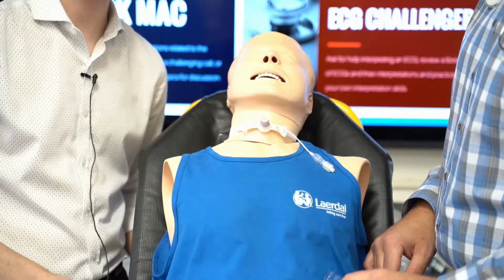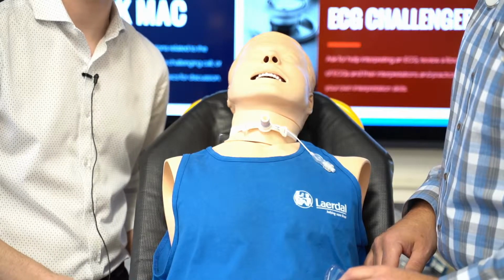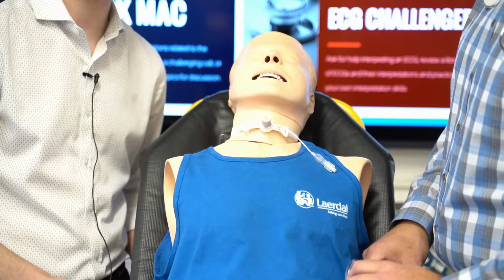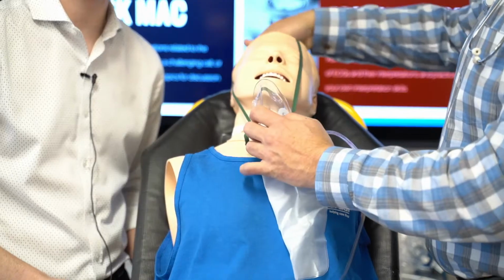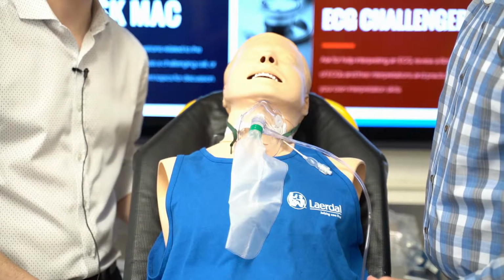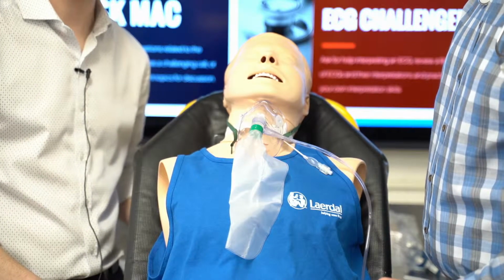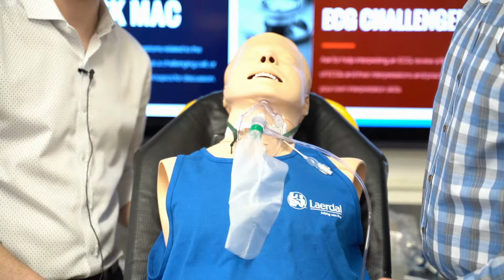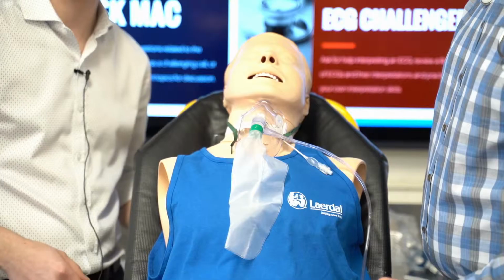With this tracheostomy patient, we've noted that there are increased secretions requiring some deep suctioning. This patient meets all the indications to apply this. First, we're going to pre-oxygenate our patient. And if we haven't already done so, we're going to prepare our equipment and apply our PPE. When performing deep suctioning, it's exactly the same for a laryngectomy or a tracheostomy patient. We've already pre-oxygenated our patient to the best of our ability, and remember, if we have any HMEs, speaking valves, or even an obstructed inner cannula, all of that is going to need to be removed before we do the deep suctioning.